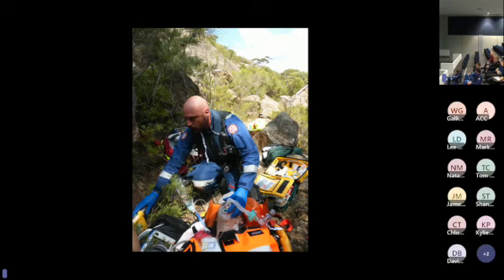This was a patient that was being intubated in a remote location, and at the time we didn't have a ventilator that we could use in that space. There was a Zoll monitor you can see in the bottom left picture of the screen, and we still don't have a great system for monitoring these patients in those remote locations. We've got this massive big monitor defib that does 1,000 things, when really all we want is arguably ECG, NIBP, SATs, and CO2.